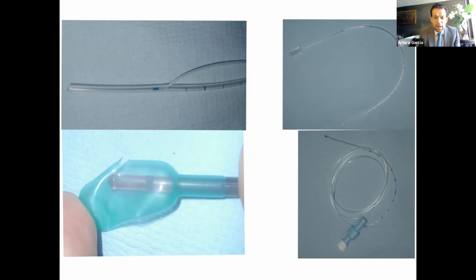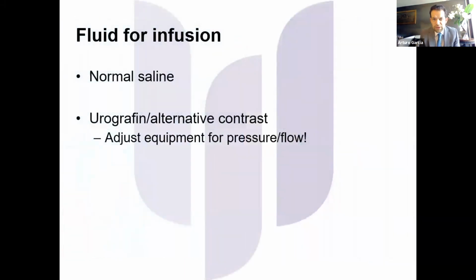So it's quite common to have people having trouble reading the abdominal line, and it's usually because they don't manage this correctly. So remember, always do a small cut, and once you flush water through the catheter, it is going to come out of the balloon, go to the rectum, and you're going to be able to measure the pressure inside the rectum with no artifacts. So this is really important.